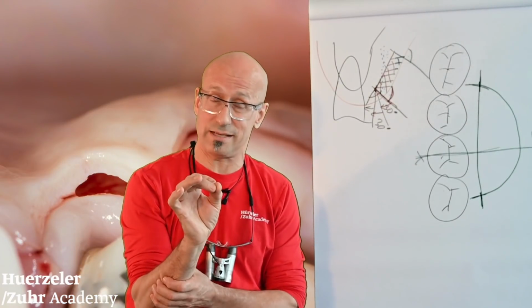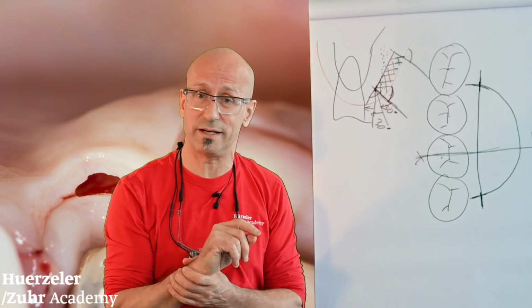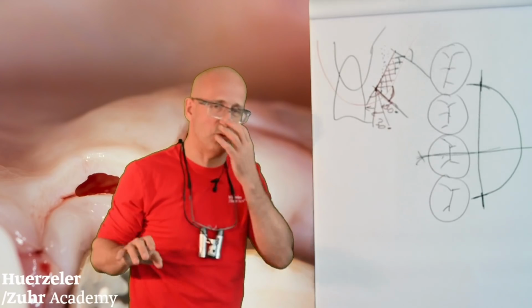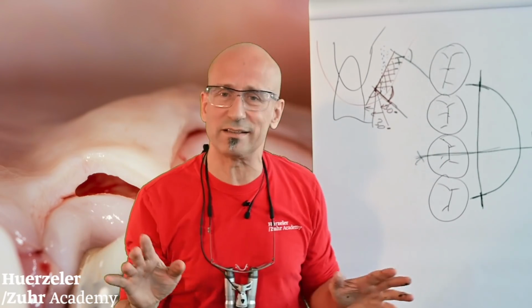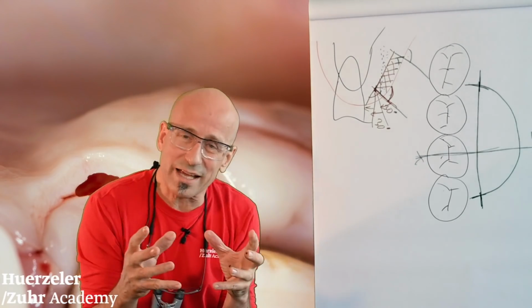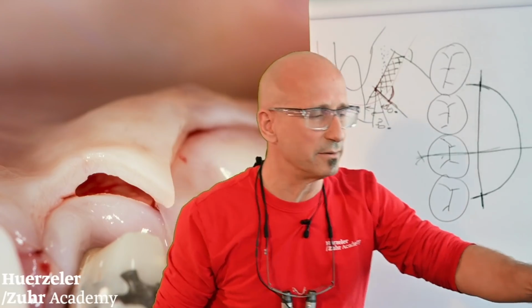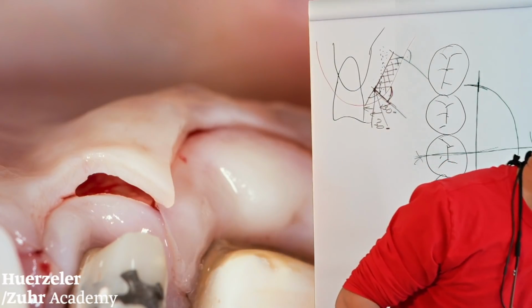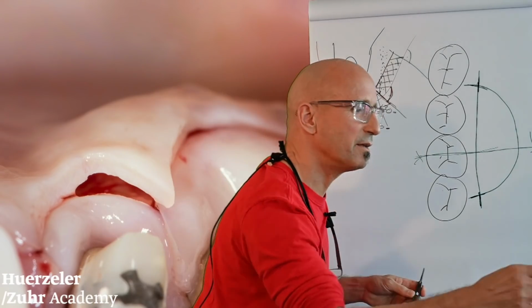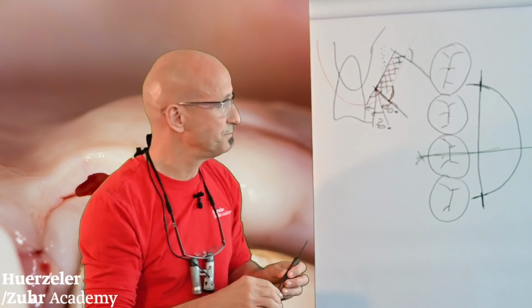And the best exercise, believe me, is harvesting a free gingival graft. So the first thing, and this is human being, I know that. We know that, we have taught so many clinicians around the world. What everybody likes to do is, give me a forceps for a second, or a plier. Everybody likes this here, look. Everybody does this, and the blade, give me a blade. We have it ready like you.